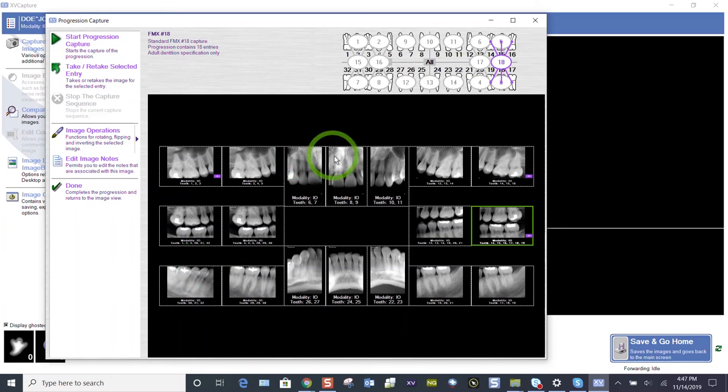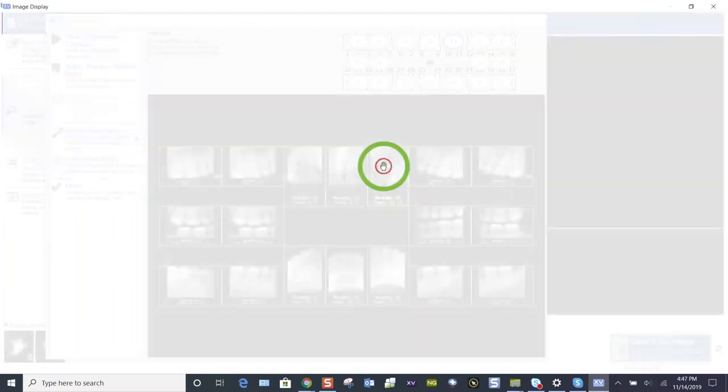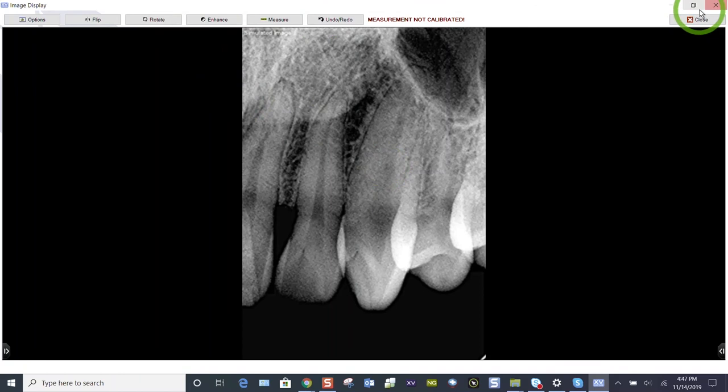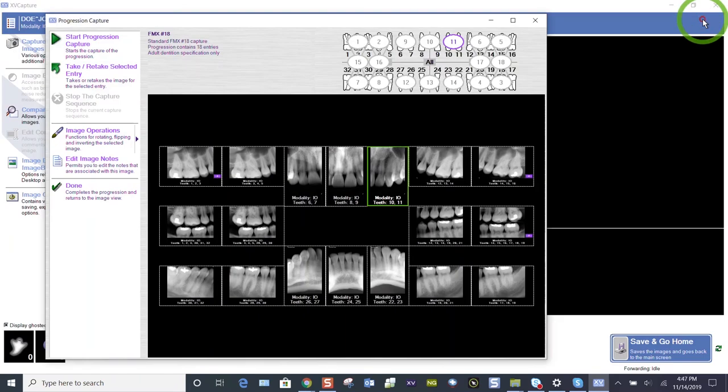If I see something on an image that if I want to look at it in a little bit closer mode, just double click and we'll open up that image to the enhancement screen. I can quickly close out of that with the close in the upper right hand corner.